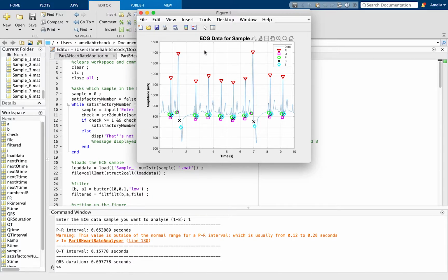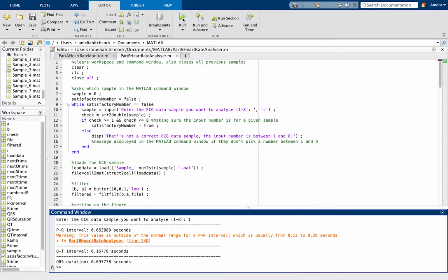So what it does is it shows the graph of the sample that's being used, and it shows you, just here in the legend, the R wave, the Q wave, the P wave, the S wave, and the T wave. In the command window, it tells you what the PR interval is, what the QT interval is, and what the QRS interval is. And if it's not in the desired range, then it gives you a warning, like it has for this PR interval. I'll now show you for the rest of them.